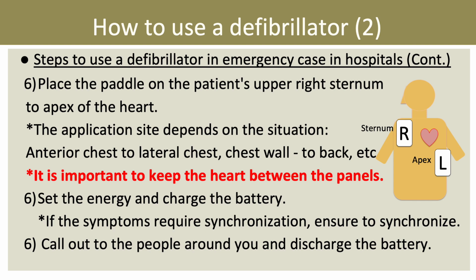Then, the next step is to charge the battery. If the symptoms require synchronization, make sure to act accordingly. Lastly, call out to the people around you, and discharge the battery when it is safe to do so. This is how to use a defibrillator in an emergency.